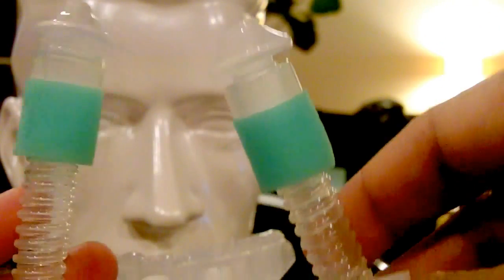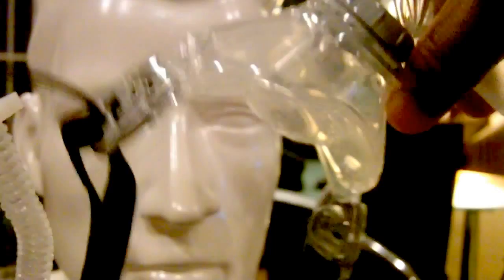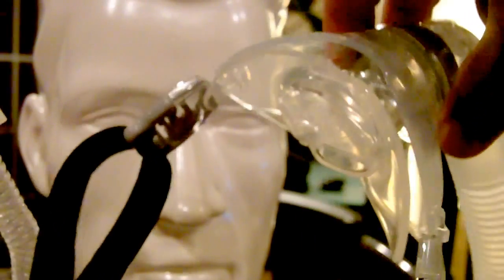Now, this is very similar to the Fisher & Paykel oral CPAP mask, the HC452. Well, the HC452 doesn't have any nasal pillows. It enters your mouth. By the way, watch the video review on this. It has very unique strengths and weaknesses I created at my website. But it comes with a headgear, and you actually can use this without a headgear too. But the difference here is this one is the nasal pillows. Now, it looks like it's pretty wide apart, right? But you can actually make it turn towards you to make it work better, closer together. This part here can come in a little bit more, okay?